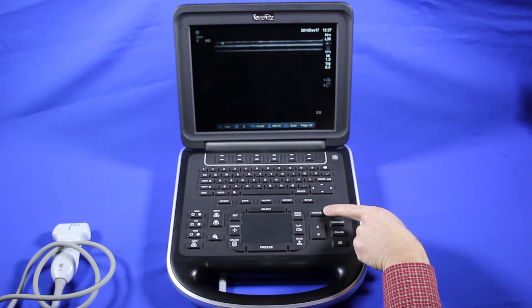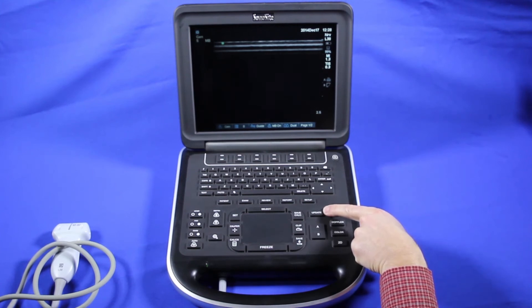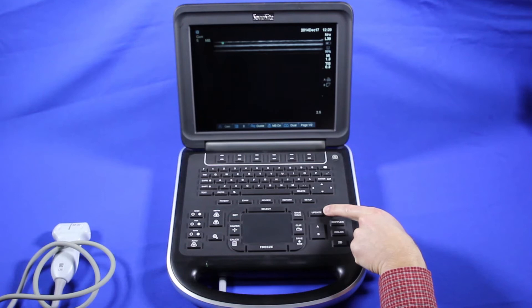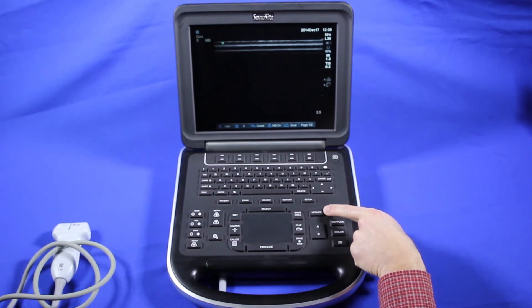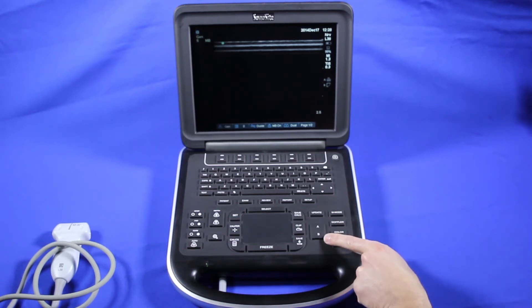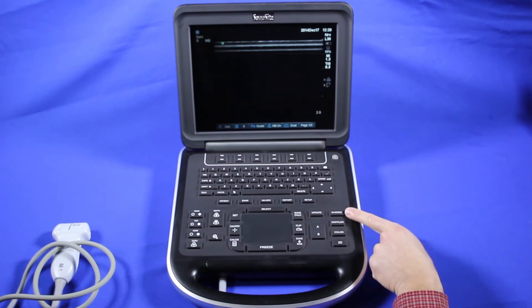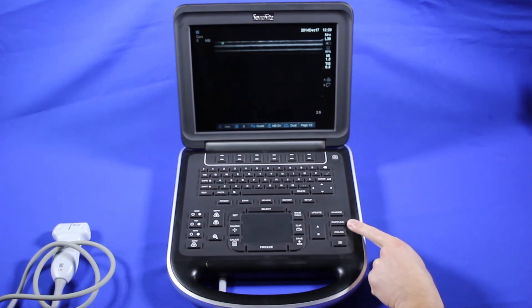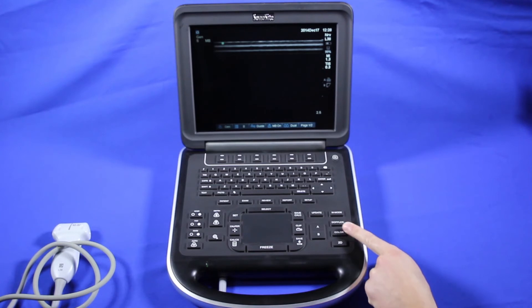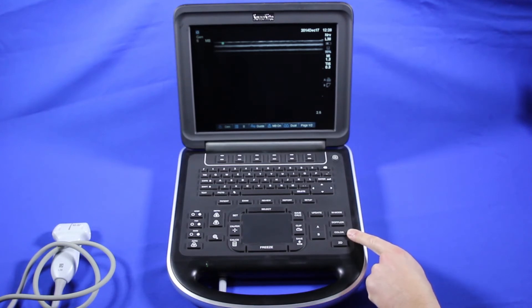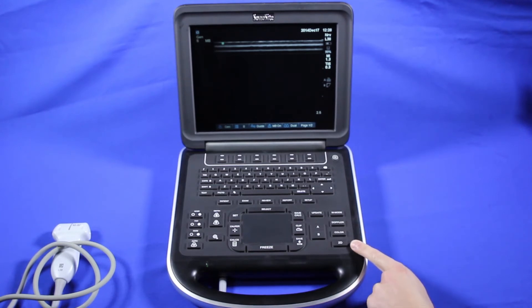The update key is for different imaging modes — it will update a screen that's frozen, your live view image, or your Doppler image. A and B are assignable keys. Your imaging modes include M mode, Doppler — which will take you to PW or CW Doppler — color, which will take you to color power Doppler or color Doppler, and standard 2D, or B mode, imaging.